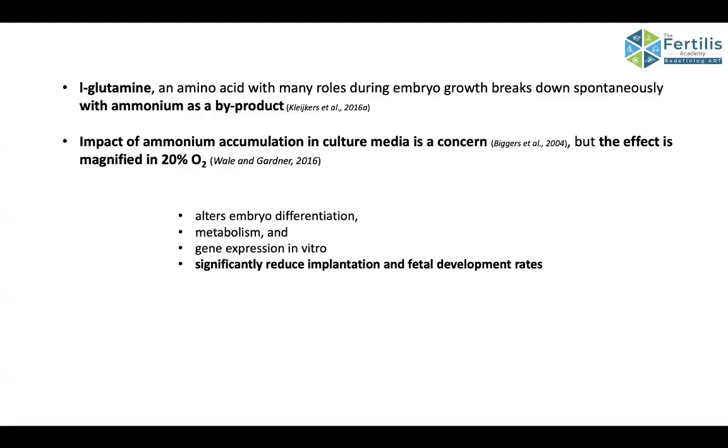A very important component is glutamine, and especially L-glutamine, the levo form of glutamine. It's an amino acid which breaks down spontaneously with ammonium as a byproduct.